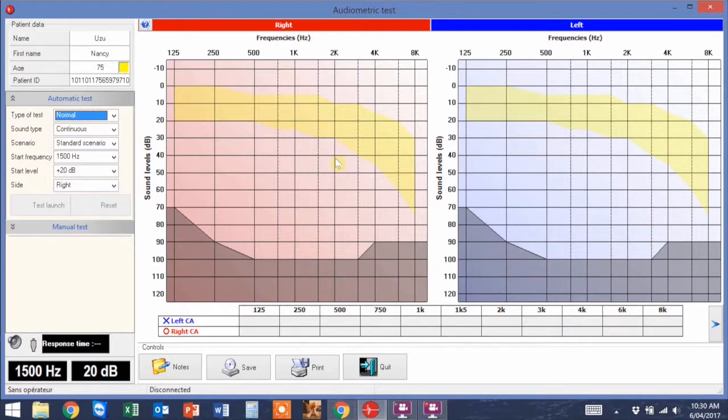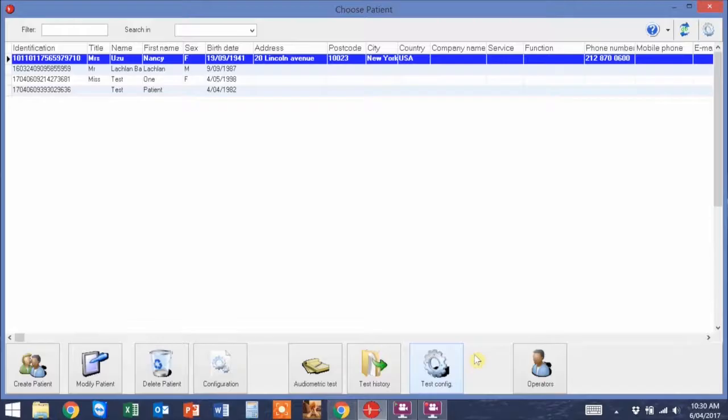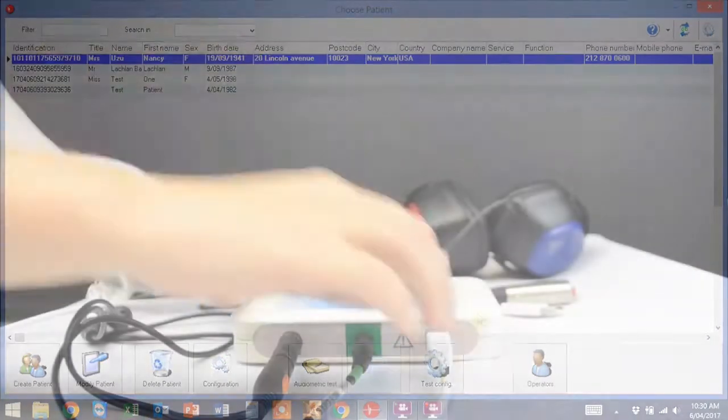To begin a test, select test launch. On the right, you will be able to either pause or play for the test. The results of the test will then come up on the right on the graphs.